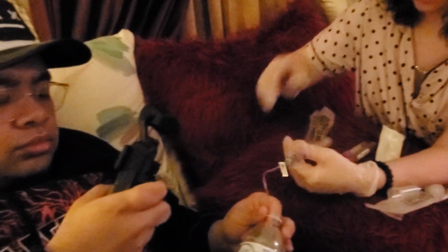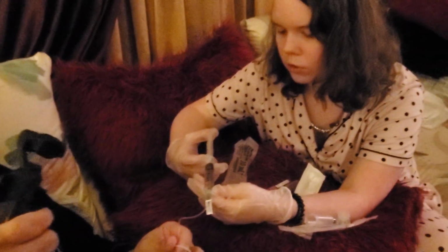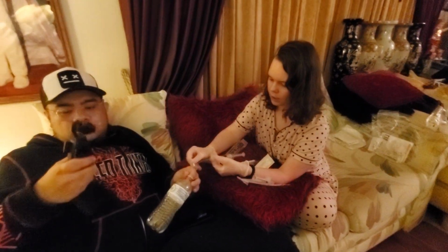Open it up. Same thing, 10 mLs over 2 to 3 minutes. But this time I don't need to aspirate blood or waste any blood because I've already done all that. So once I disconnect this syringe, it's going to be empty. So pretend this is empty. I'm going to take this and clamp it back.